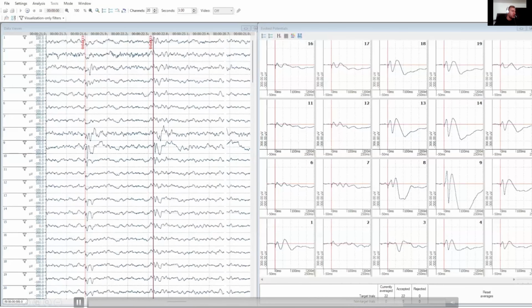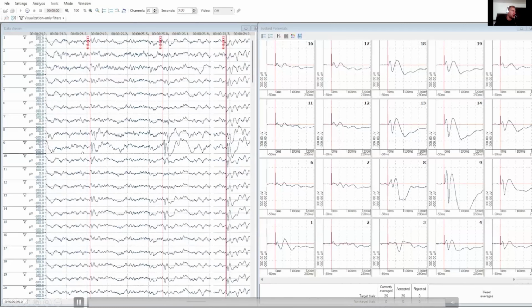Usually we have to record a CCEP recording at least with 1200 Hertz, preferably 2400 or even higher. The higher the sampling rate is, the more we can also resolve very early components and distinguish them from the stimulation artifact at the beginning. But it is important to understand that these evoked responses are usually quite big, a few hundred microvolts in amplitude, and we can average, let's say after 10 to 20 trials, already a good waveform that we can distinguish from baseline.